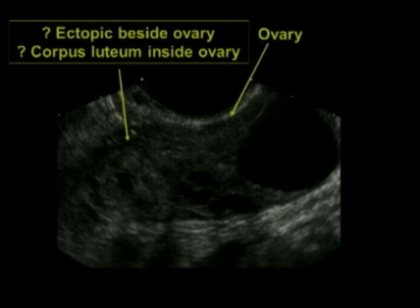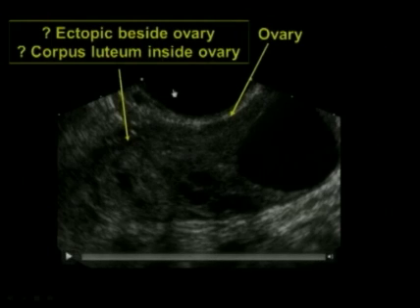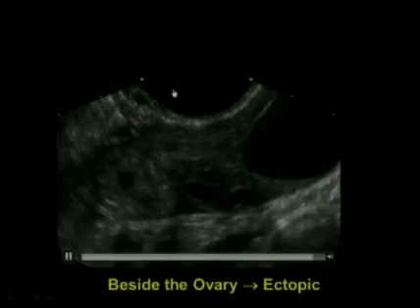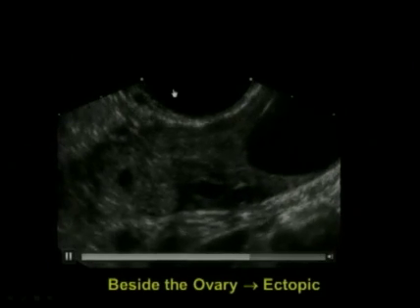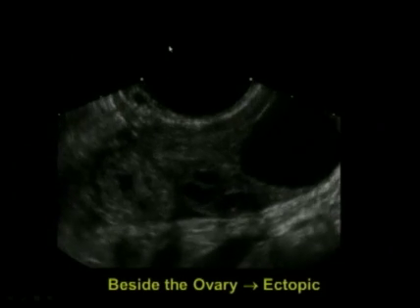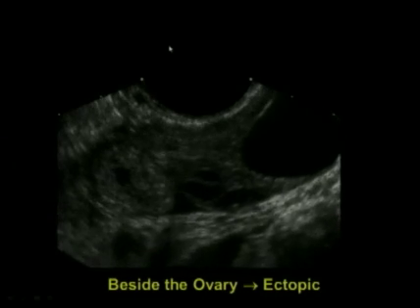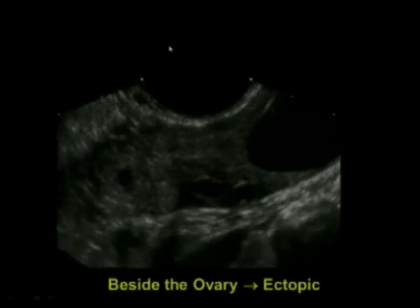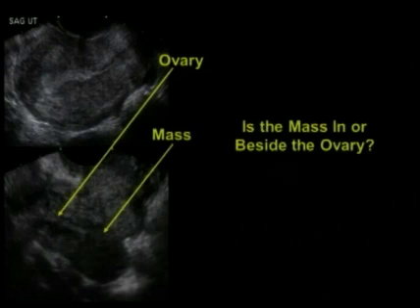Well, you tell the difference in many cases by taking advantage of the fact that ultrasound is a real-time specialty. Your transducer is sitting right up against the ovary. Push it and see if these two move together or separately. And here's what happens when we push. You can see that those 2 structures move separately. This is beside the ovary, so it's an ectopic pregnancy. If they move together, we would have concluded that it's in the ovary and probably just a corpus luteum.